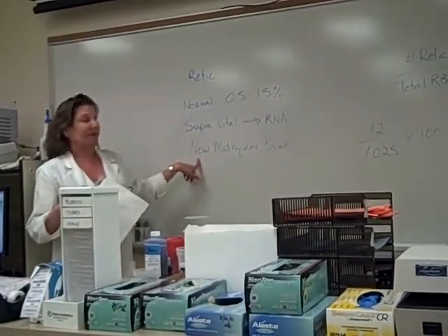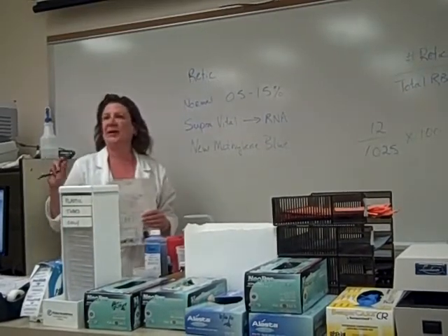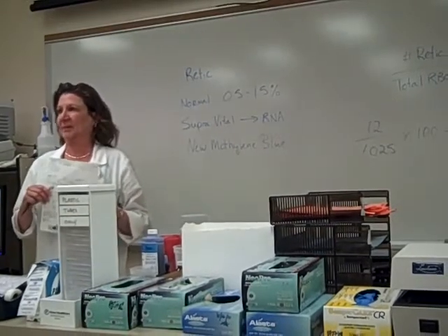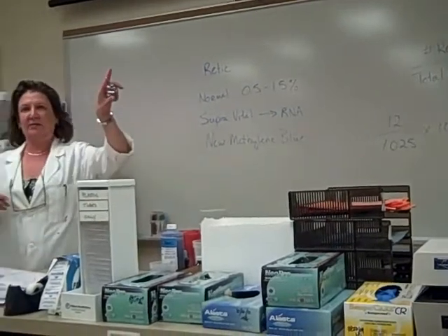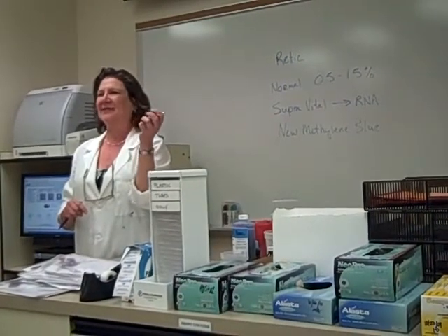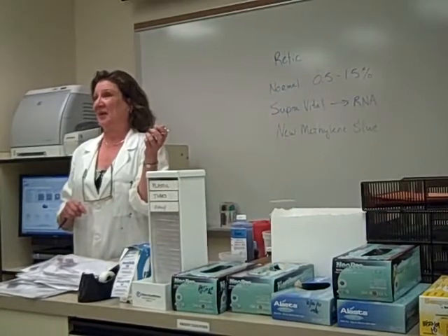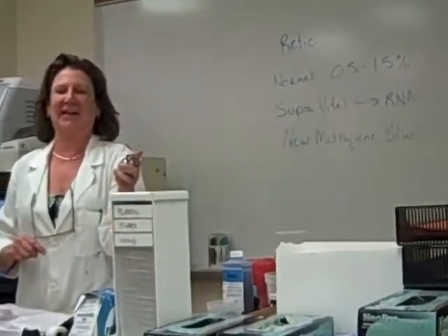The supravital stain we're using in class is new methylene blue. There's a couple of other different versions, but we use new methylene blue. So the idea is you're all going to get a tally counter like this. They're up in the cabinet up there. And with your left hand, you're going to count, guess how many red cells? At least 1,000. Okay? At least 1,000. I can't count that. Yes, you can count that way.